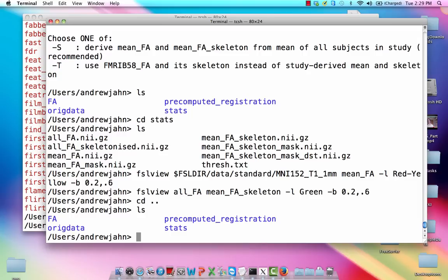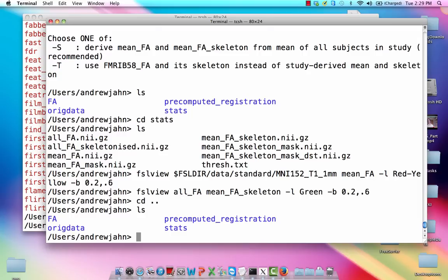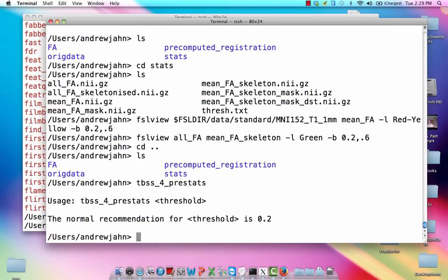So the final TBSS step before doing our GLM is TBSS4, naturally enough. And all this is going to do is basically it works the way any other kind of thresholding does, like thresholding for masks, thresholding for brain extraction.